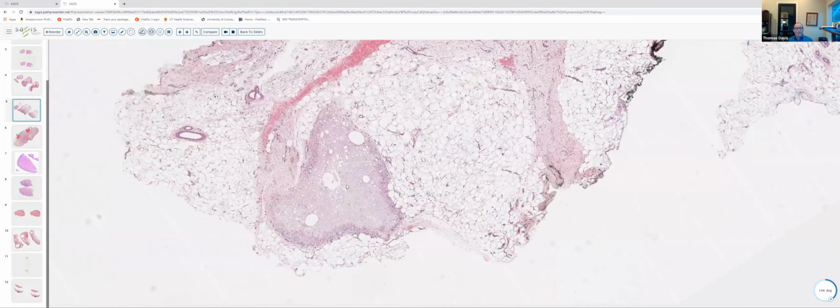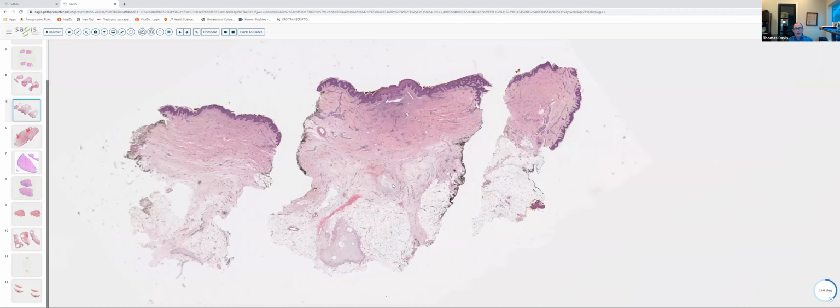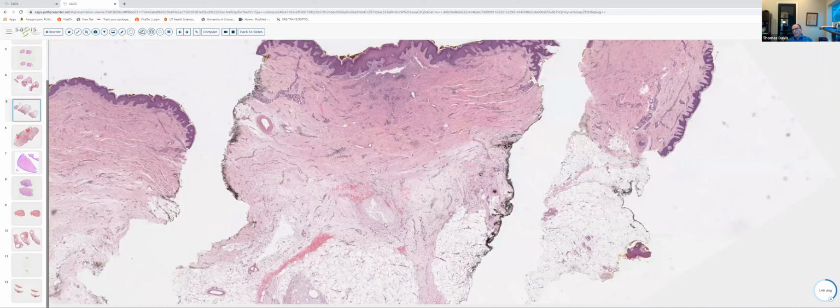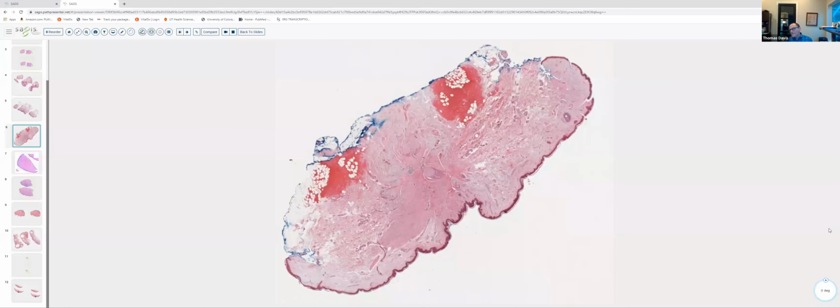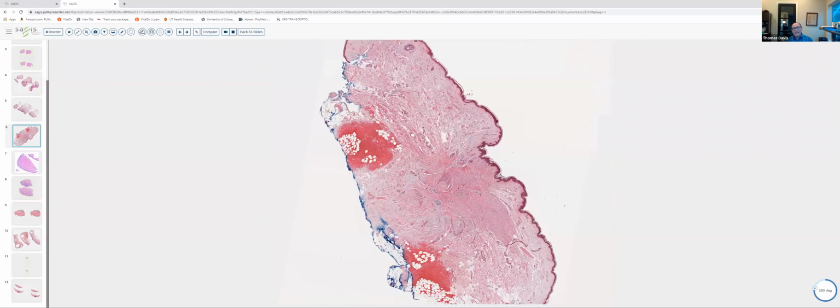And again, one caveat that we always try to teach people in dermpath is never be pleased with just one diagnosis. Make sure you look around to see if you have more than one thing going on. Okay, continuing our discussion of things fibrotic, I'm going to flip the slide.